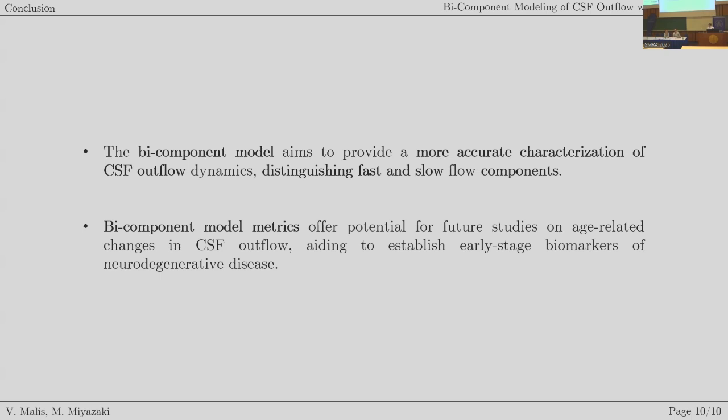Which parameters? Yeah, there are multiple of them. I think some of them that might change would be the peak height, and probably also depending on if there is any disease, we may see an increase, for example, of the actual CSF bulk motion compared to the perfusion component. So those are the parts that we expect maybe to see in the later studies.